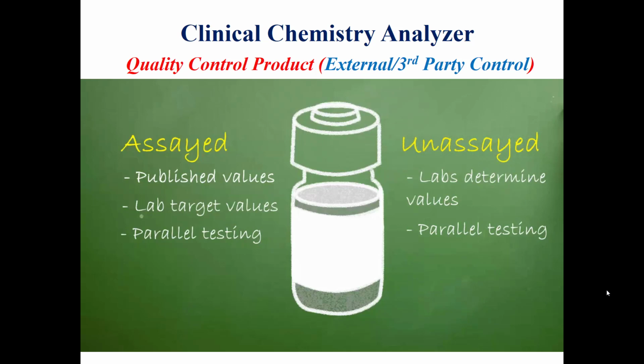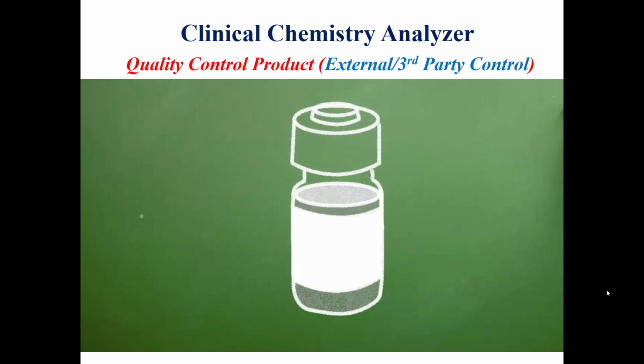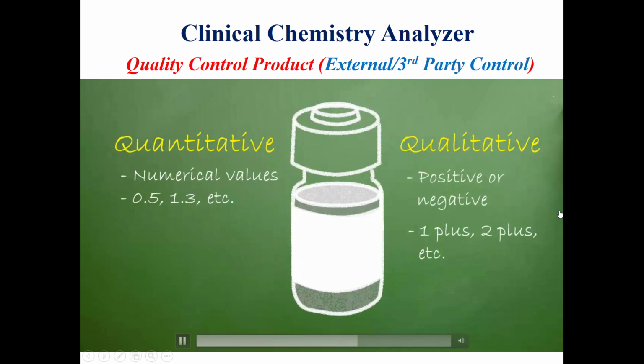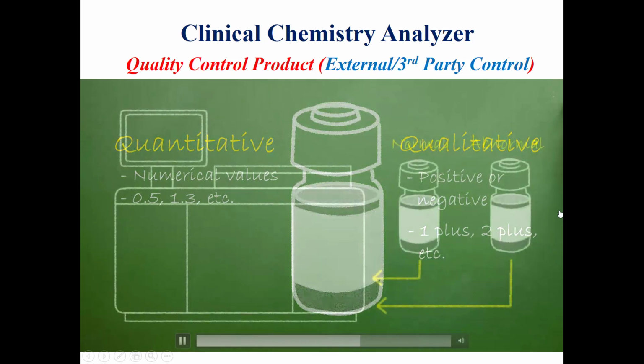Laboratories must also determine their values for unassayed controls by performing parallel testing of new and old lots. Another way to categorize controls is quantitative or qualitative. A quantitative control is used for tests that are reported numerically. A qualitative control is used for tests that are reported with a statement like positive or negative.